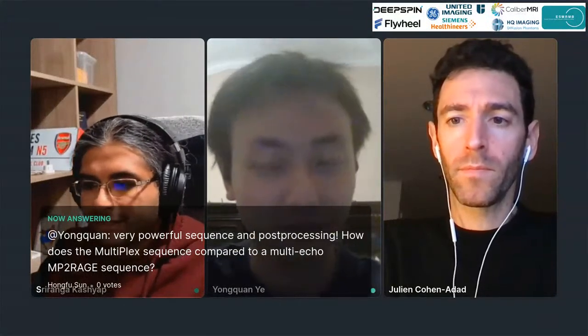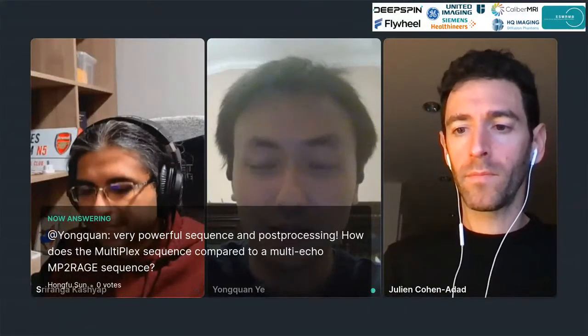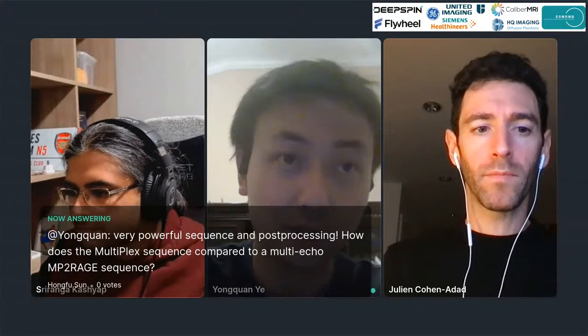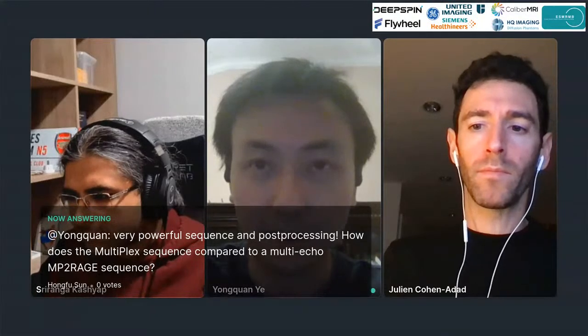I think the next question also synergizes with the question that I had. It's a very powerful sequence that you have and the post-processing, but how does it compare to multi-echo MP2RAGE or other MR fingerprinting-like sequences, which also provide you multiple quantitative contrasts? Yeah, that's a very good question. From other vendors, right? Yes, I think it's from Siemens. The MP2RAGE, if I remember correctly, also offers T1, T2 star, and QSM. But I don't think it offers the proton density mapping.